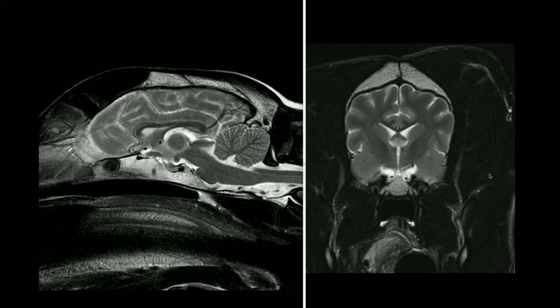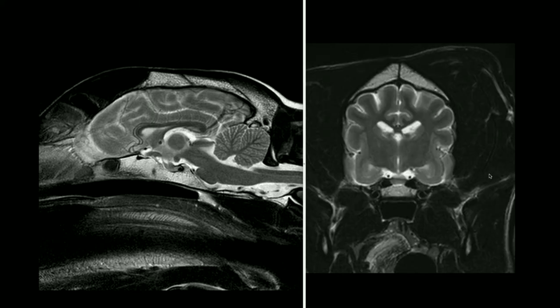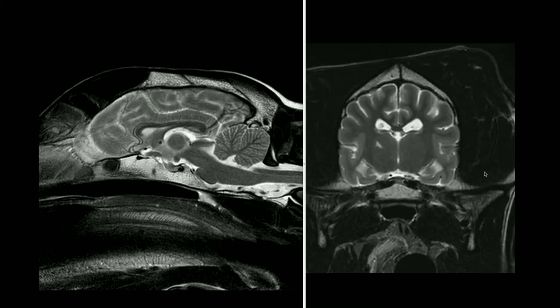As we scroll through, we see a small lesion here in the right thalamus, very angular in shape. We can see there's no mass effect, no swelling, and although it's quite small so we wouldn't necessarily expect a huge mass effect, it is very sharply marginated in a curious wedge-shaped angular shape.